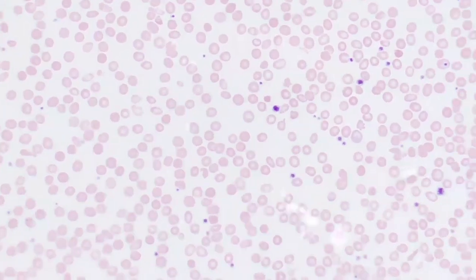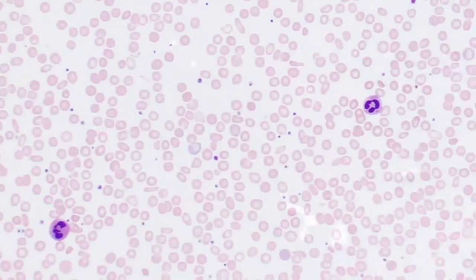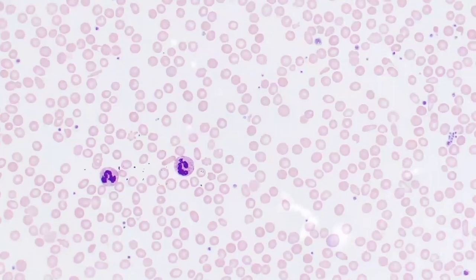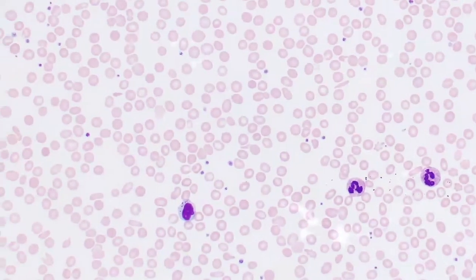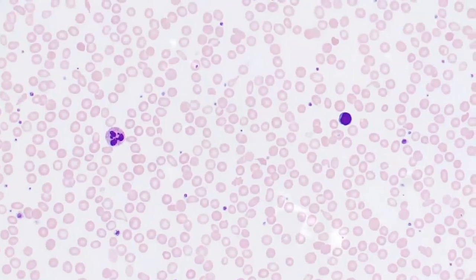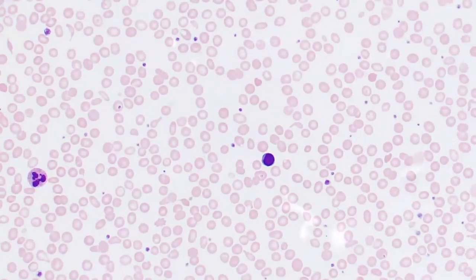If we go a little bit closer, we can scan around and look at the white cells just to get a familiarization with the white cell morphology. And here again is a prominence of platelets in the background. So we already think that this probably has a higher platelet count than we're used to seeing. After we determine that the white cells are relatively normal, we can go on to 100x.